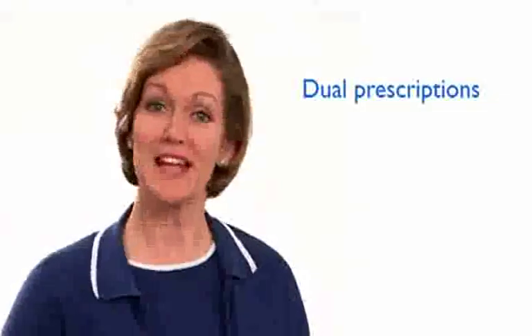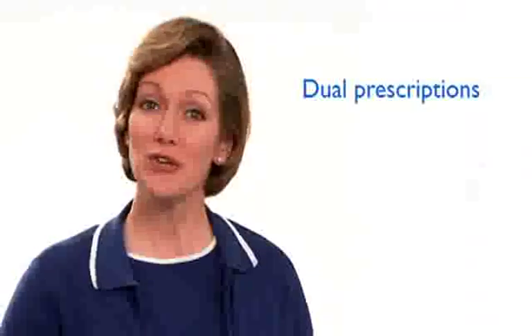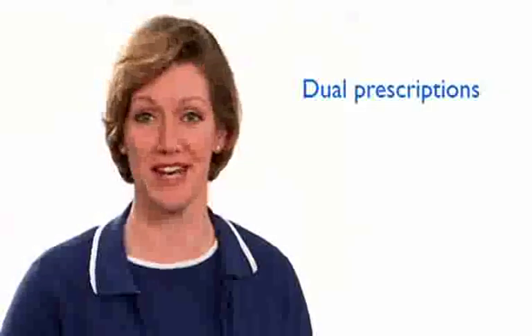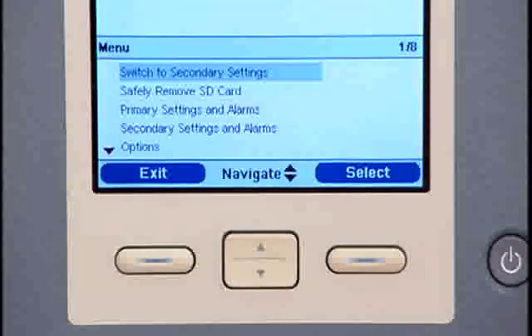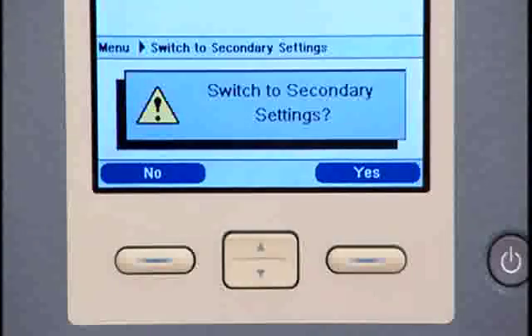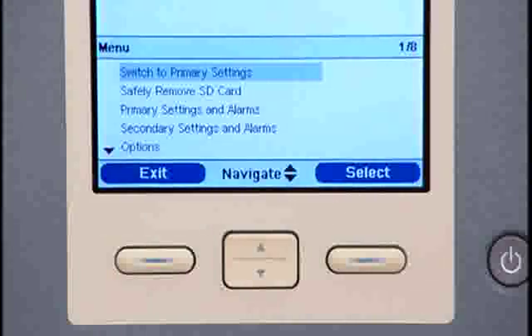If the home care provider has set up a dual prescription, this option will appear on the menu screen. You can change to either your primary or secondary prescription settings. Use the center up-down button to highlight the switch to primary or switch to secondary options, then press the right button to select it. Trilogy 100 will ask you to confirm the change. Press the right button to answer yes and switch to the new prescription.